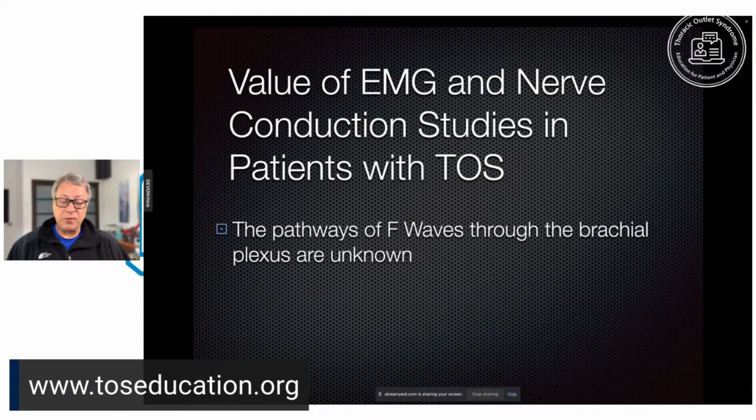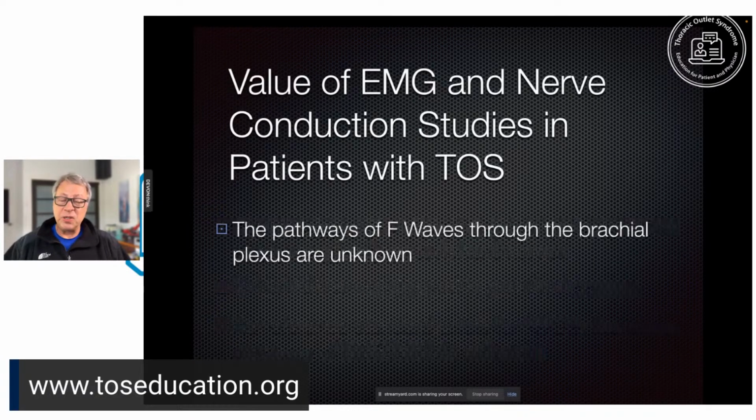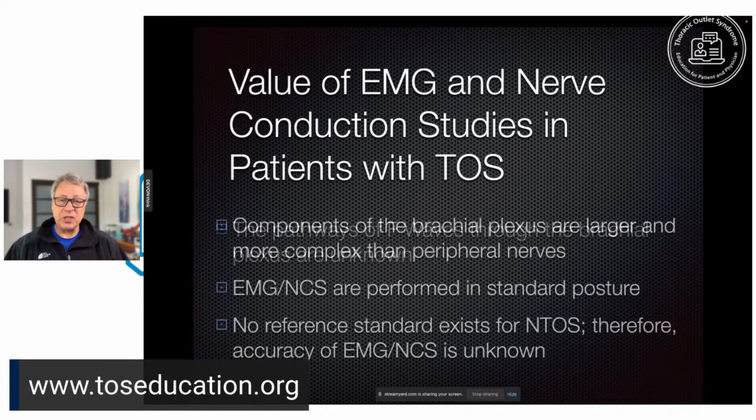All right, F waves. When you do an F wave, it's this reflected wave that goes back up towards the spinal cord, rattles around a bit, and heads back down the nerves and gives you a small compound muscle action potential at the end. Again, only 2% of the cell bodies in the spinal cord respond. It's a different population each time. Really, it goes through the brachial plexus, which is 5 complex roots and lots of branches. So F waves don't really help. All right, let's take a look at 3 more. I'm going to take these one at a time.